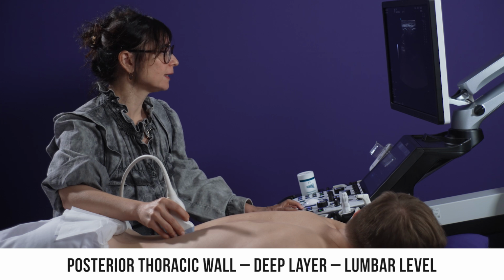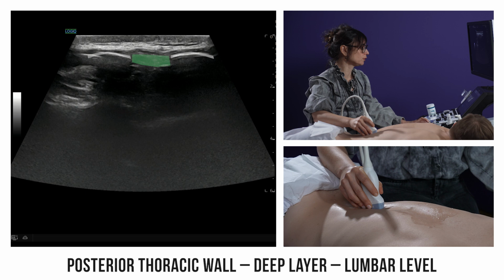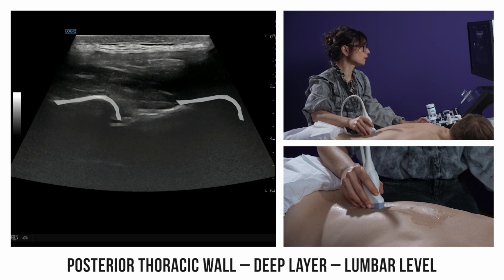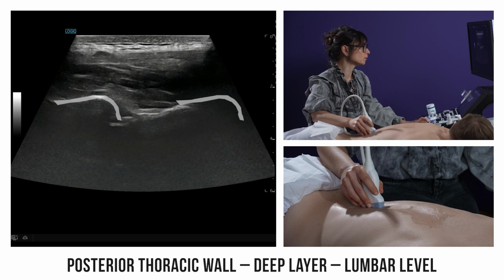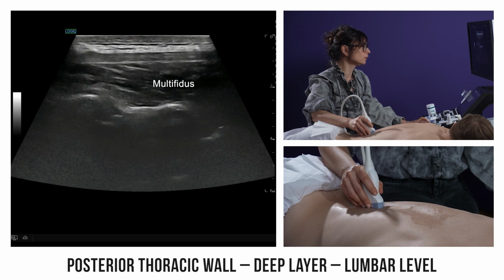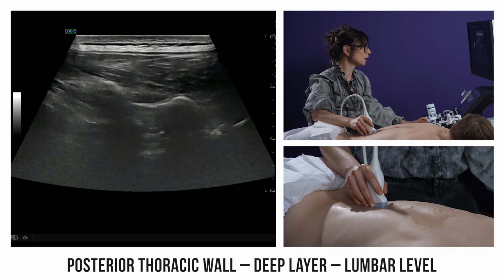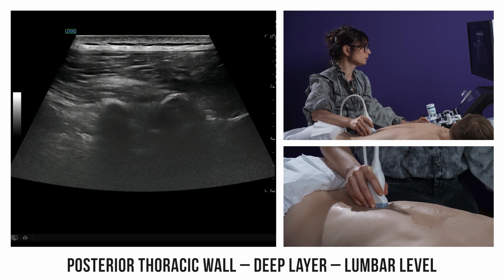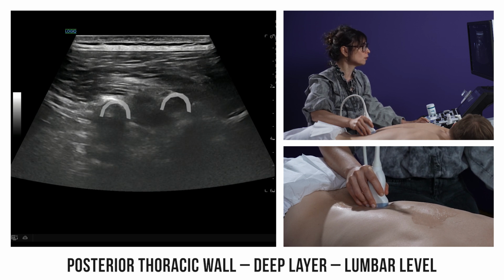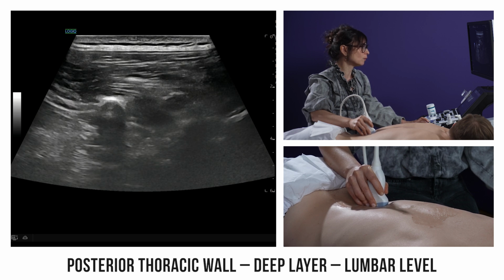Now, in a sagittal view along the midline, we see the spinous process and the interspinous ligament. Sliding the probe laterally reveals the laminae, again shaped like horse heads, over which lie the different multifidus bundles. Further lateral still, we observe the joint masses, rounded and sometimes described as resembling camel humps, over which fibers of both the multifidus and the longissimus intermingle.